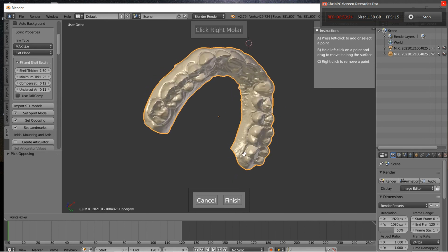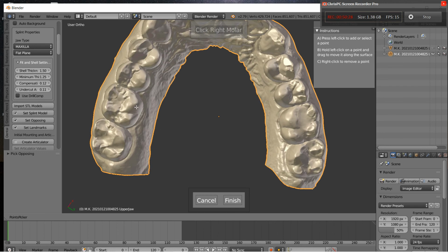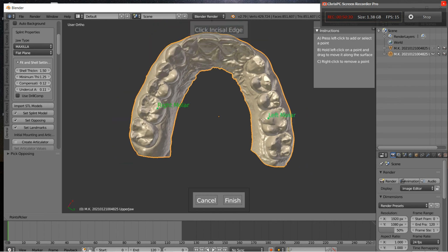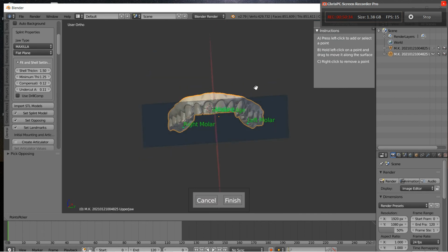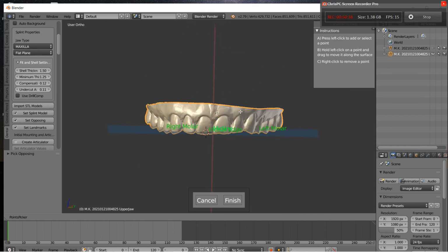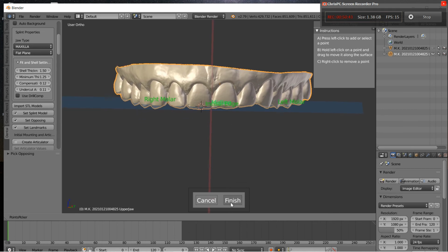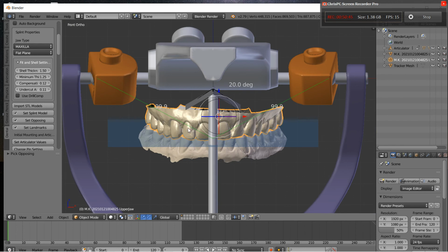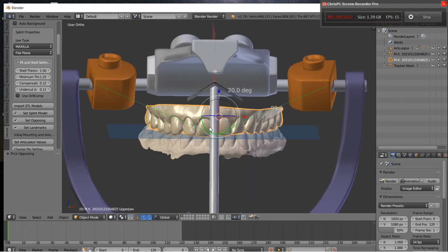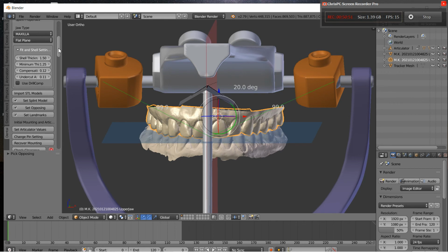If we follow the directions on the right hand side of the screen, what we're going to do next is select some landmarks so we can put this onto what's called a virtual articulator. So I imagine that I've now, 5 minutes after scanning the patient, chairside in my scanner, I have a mounted model on a semi-adjustable articulator. I physically can't do that process that fast out of alginate.